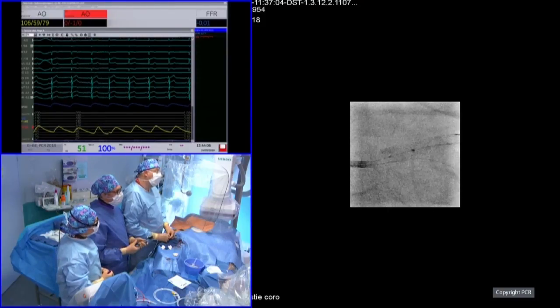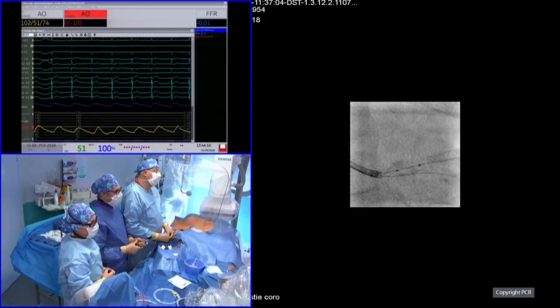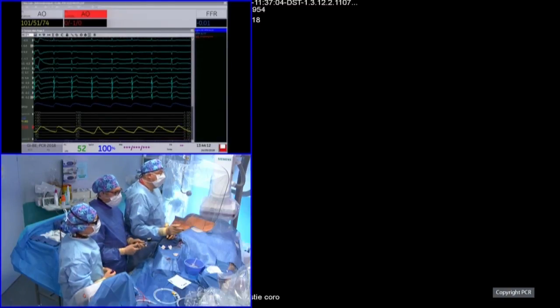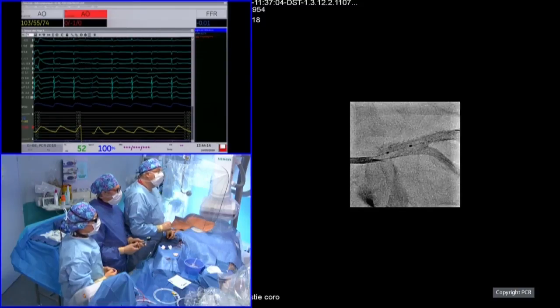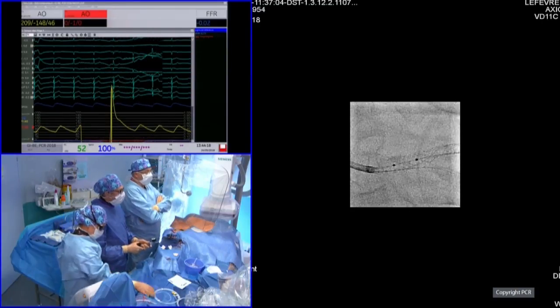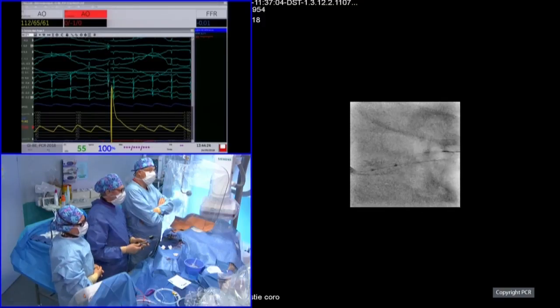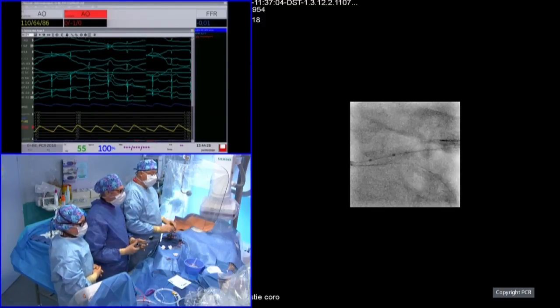Yeah. So maybe Goran, you have seen that we have done a stent enhancement in order to have an optimal positioning of the balloon. You know, Thierry, each time I follow a transmission from Asia, I learn something, so I really enjoy it very much. And even Var is in the audience, just to let you know.